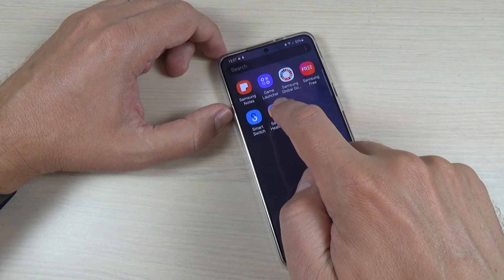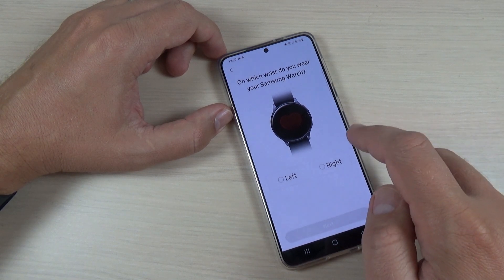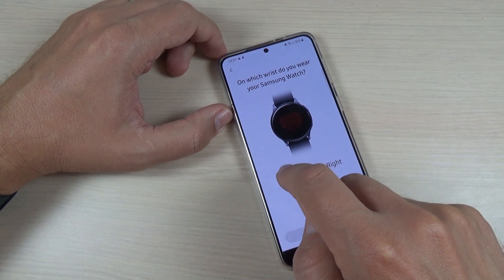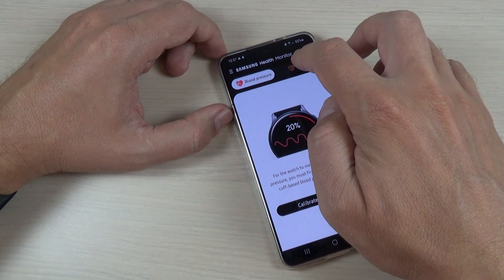Let's go to Samsung Health Monitor. Press accept and select where you wear the watch. I wear it on the left hand, press next, and select ECG.